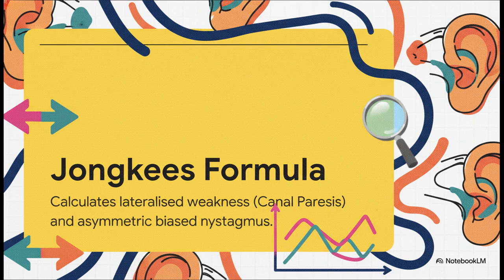The key is the Jongkees formula. This is what translates those temperature-induced nystagmus responses into concrete, actionable numbers. The formula essentially spits out 2 main values you really need to care about: canal paresis, which indicates lateralized weakness, and directional preponderance, which flags an asymmetric bias nystagmus.